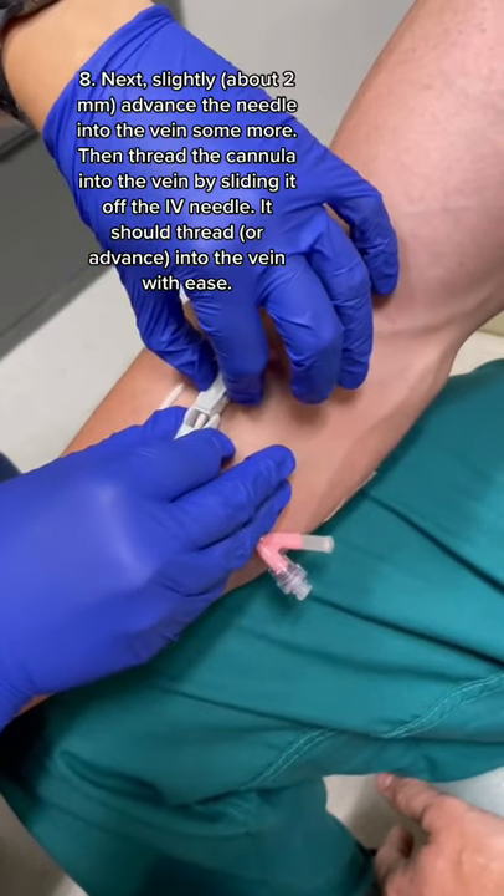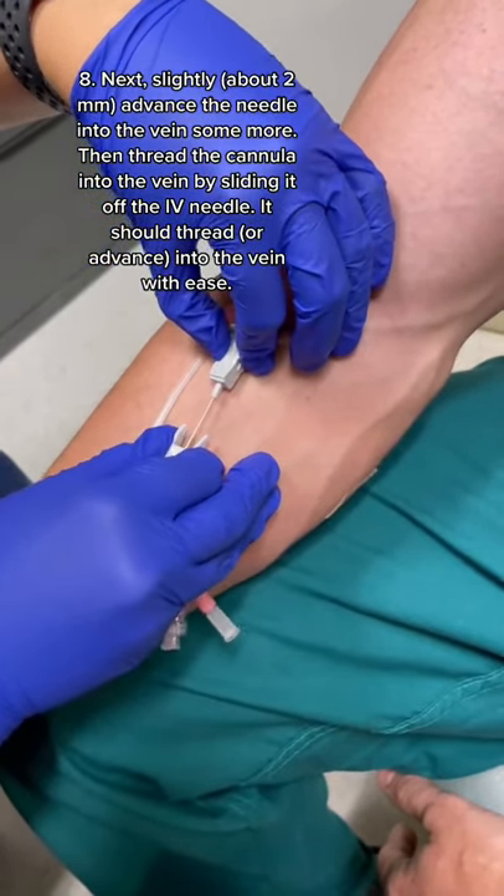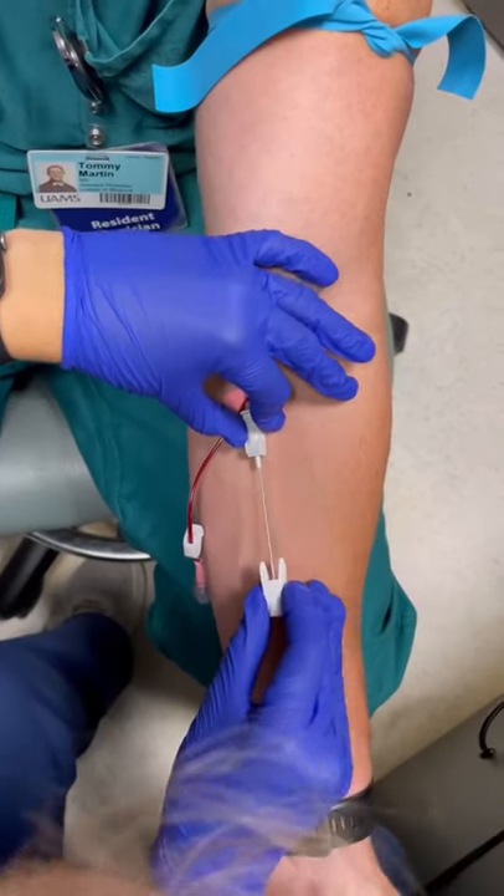Then, advance the needle just a tiny bit more. Then, thread the cannula into the vein by sliding it off the IV needle. It should thread in the vein with ease.